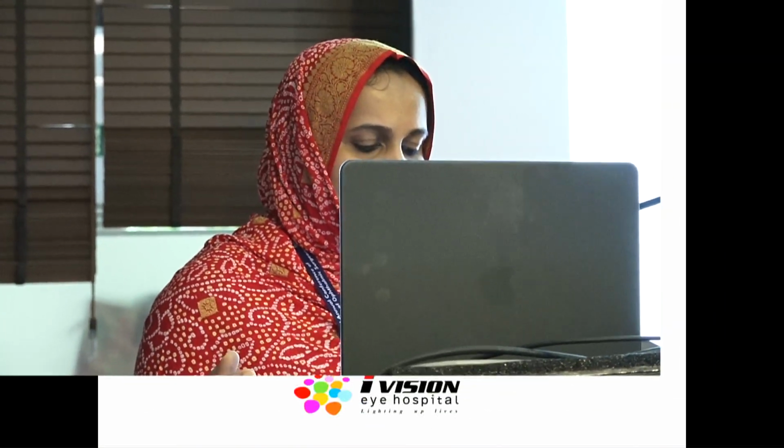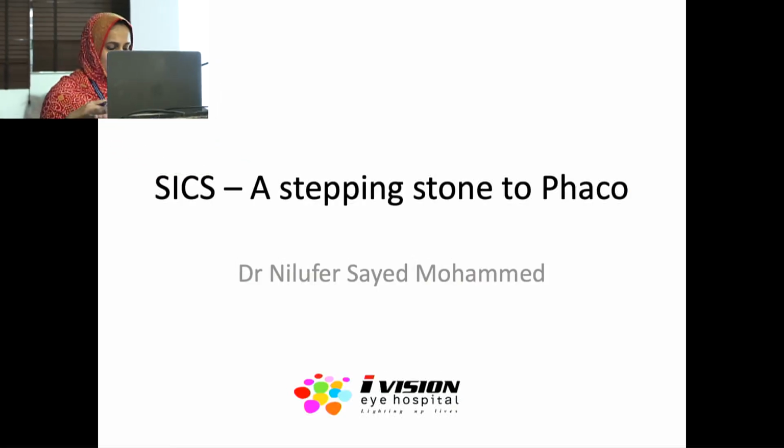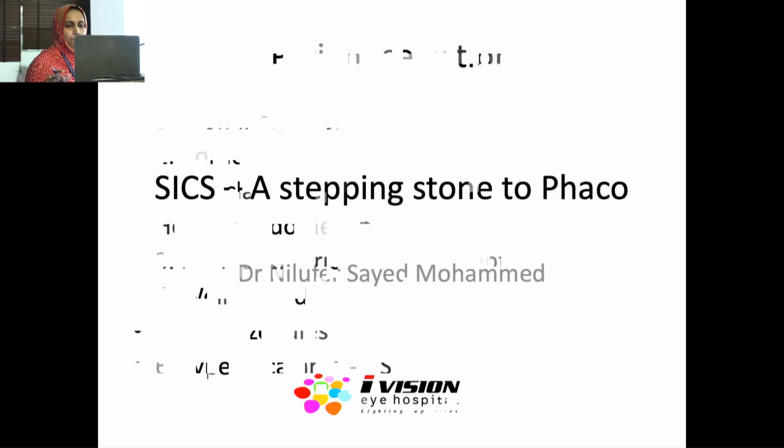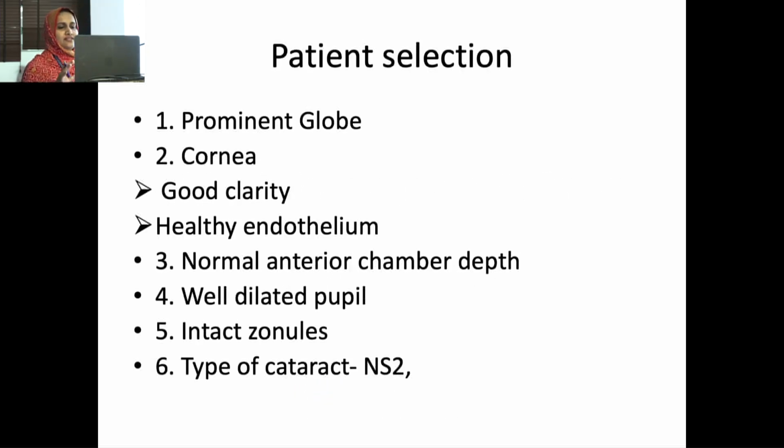In this segment, we will explore how mastering SICS lays the foundation for a perfect transition platform to move into Phaco confidently. For a beginner surgeon, it's very important how to select the patient. The patient should have a prominent globe, not a deep socket. The cornea should be clear with a healthy endothelium, and the AC should be of normal depth, not shallow. Pupil should be well dilated with intact zonules and an NS2 to 3 type of cataract.